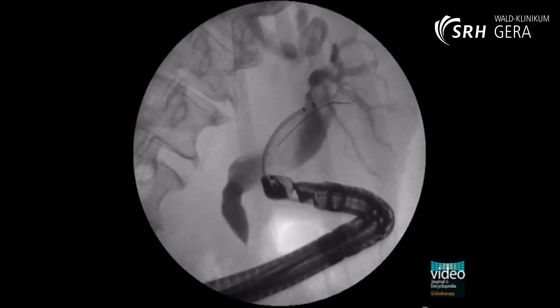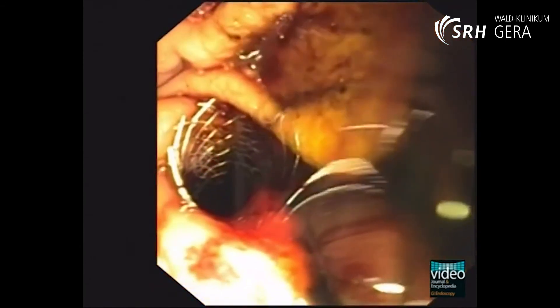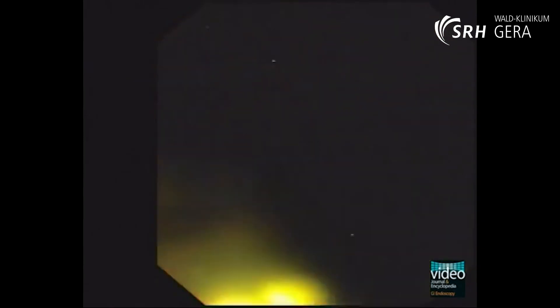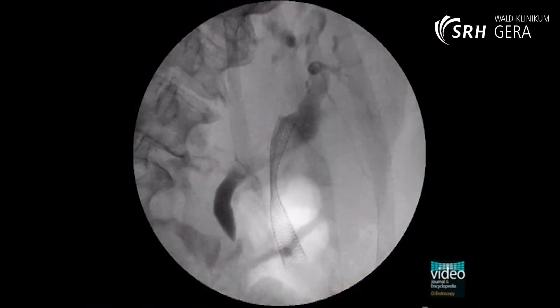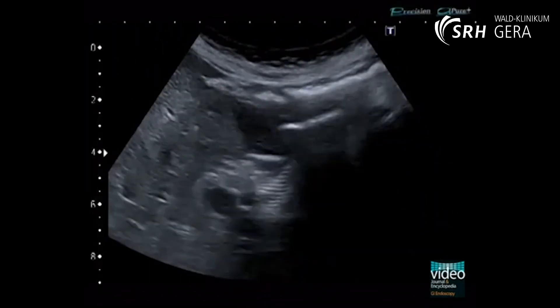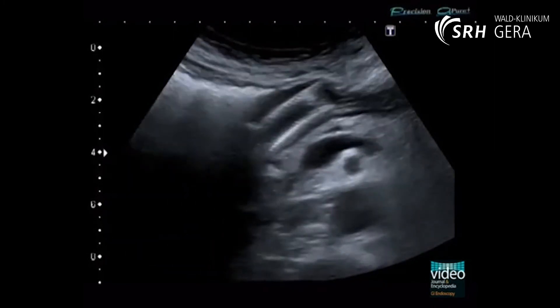The stent delivery system, armed with a fully-covered metal stent, is pushed over the guide wire. Delivery starts when the stent is positioned near the bifurcation of the biliary system. The endoscopic view shows stent delivery in progress. The favourable position of the intraduodenal part of the stent should be nearly 1.5–2 cm within the duodenal cavity. The sequences show that the intraduodenal stent part is directed through the pylorus into the gastric cavity. Further control fluoroscopy confirms correct stent position, and effusion of contrast media into the stomach can be seen.